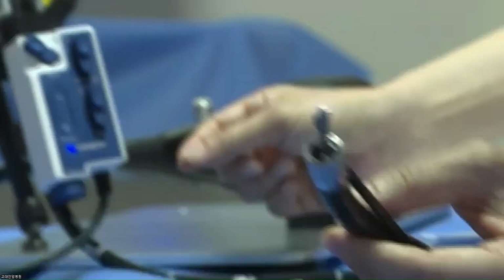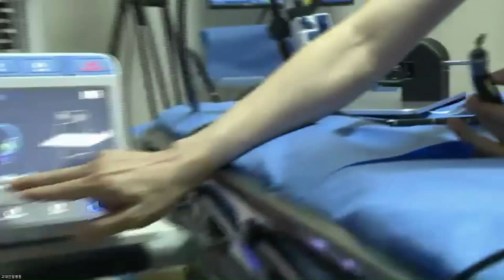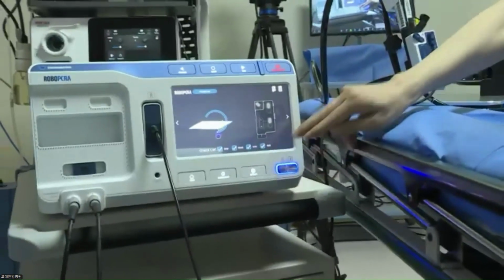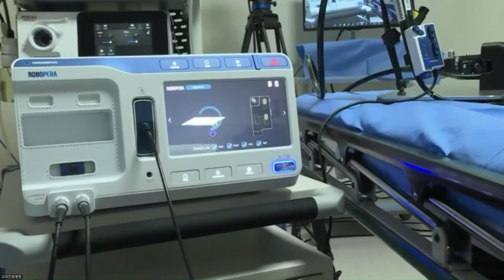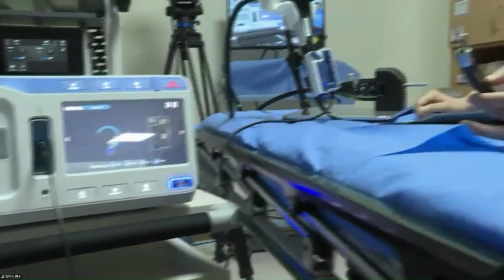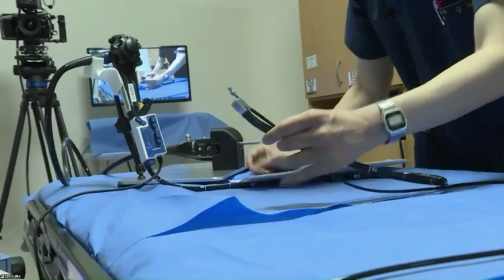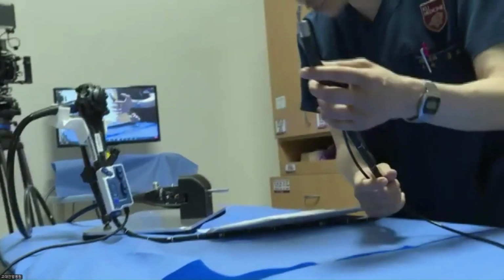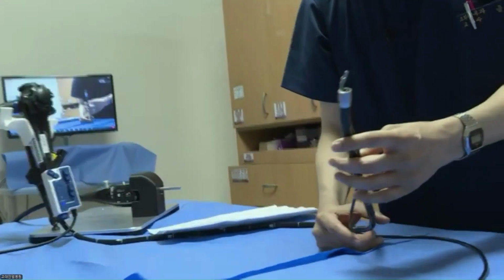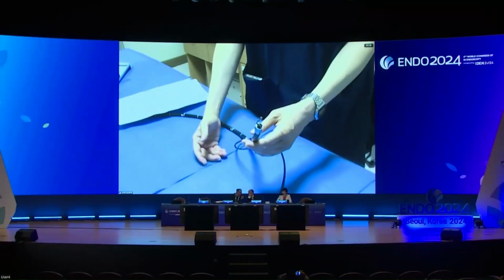After inspection, you can see the panel, and there are 4 check boxes underneath. Now the device is ready to go. I think this installation process is intuitive and easy to follow. Professor John, are you ready? Okay, let's move on to the patient procedure.